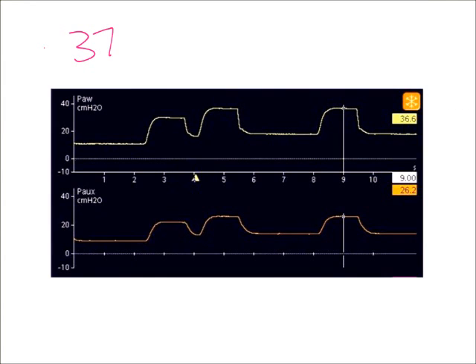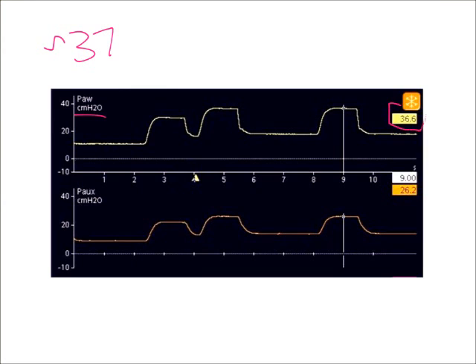From the measured values, I had approximately an airway pressure of 37. We scrolled over and we're evaluating the two separate pressures. Here's my peak airway pressure, which at this point is 36.6 or approximately 37 centimeters of water.